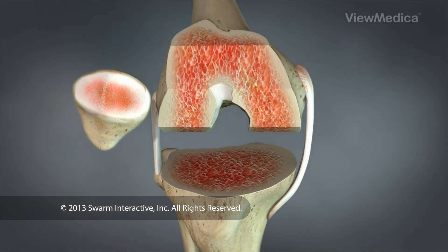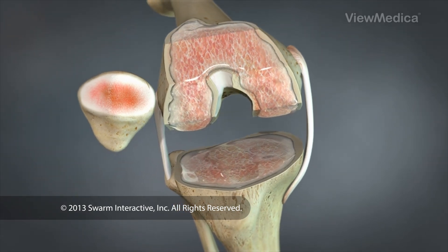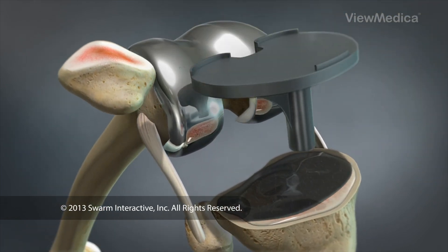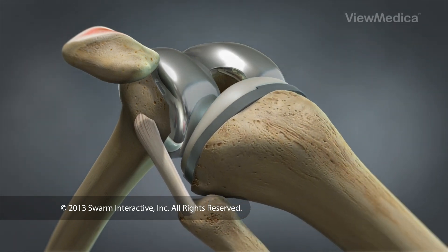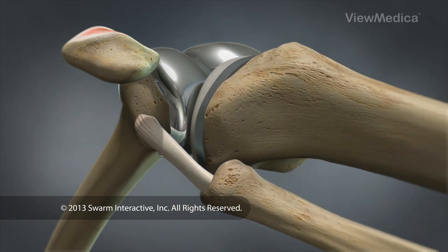After the bones have been prepared, the surgeon may apply bone cement to stabilize the components. The surgeon inserts the metal femoral and tibial components and secures a plastic spacer onto the tibial component. The spacer will allow the femoral component to glide smoothly and naturally as the knee is used.